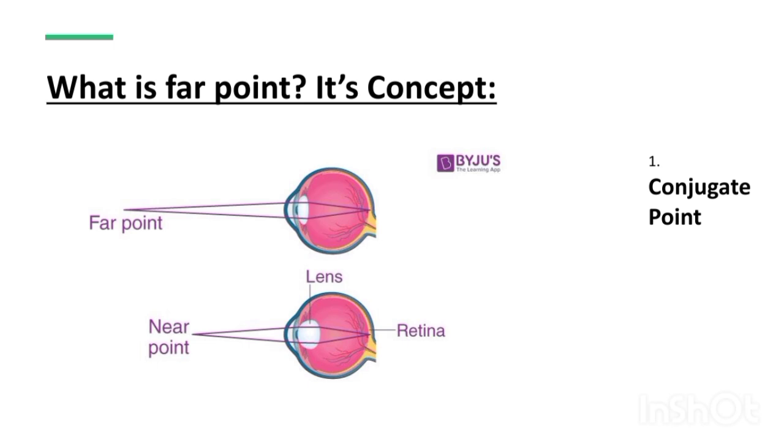And one more thing, I will explain later: when we do retinoscopy in front of the patient, we will get the with movement and the against movement, like this. And we get the neutral movement in retinoscopy only when we keep our retinoscope at the far point of the patient's eye.